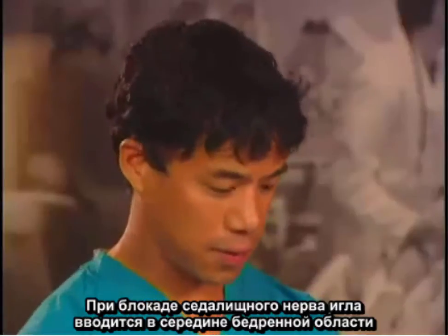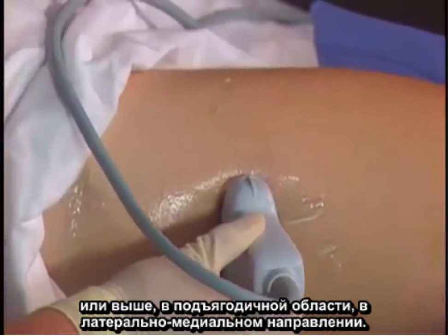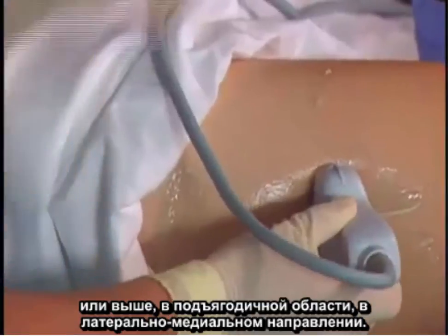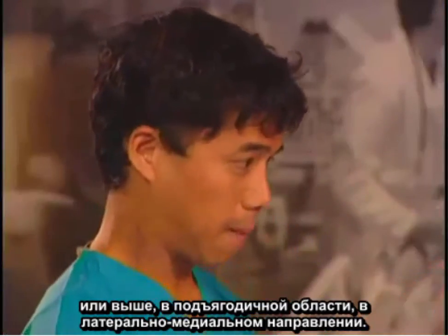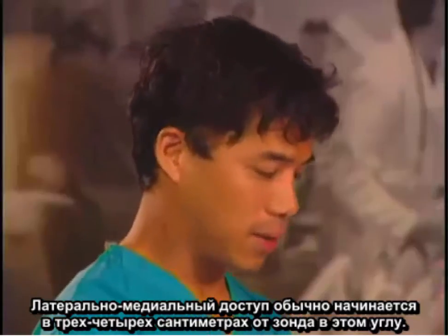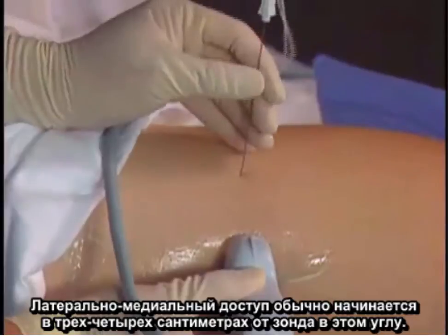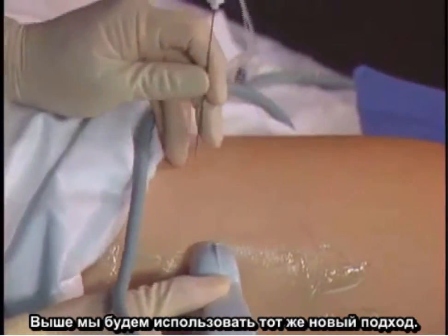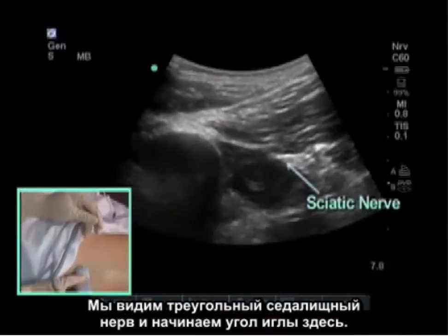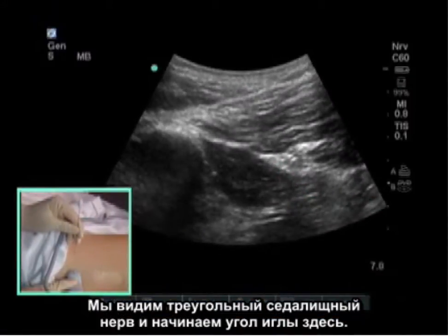Needle approaches for the sciatic nerve block, whether it be here at the mid-femoral region or higher up at the subgluteal region, are performed from a lateral to medial approach. The lateral to medial approach usually starts 3 to 4 centimeters away from the probe in this angle. Now, higher up we'll use the same needle approach. We can see the triangular sciatic nerve here, and we'll start the needle angle about here.